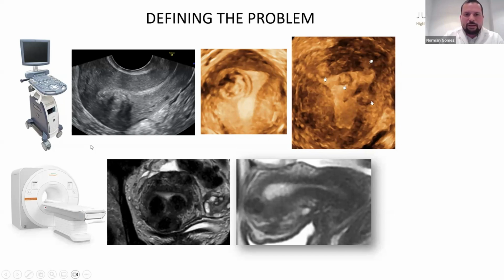For example, in a polymyomatous uterus, it is more precise for studying the localizations of all the fibroids and their limits, and the MRI is not operator dependent. So it's a good tool, but whichever you use will be the same. Today, with the new imaging techniques, both techniques are comparable.